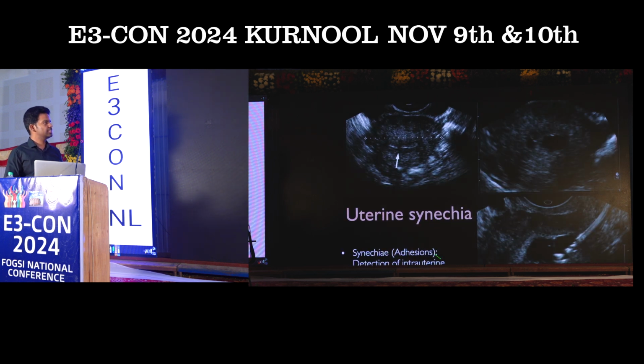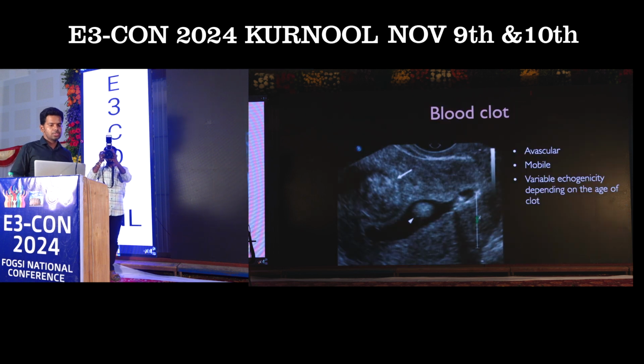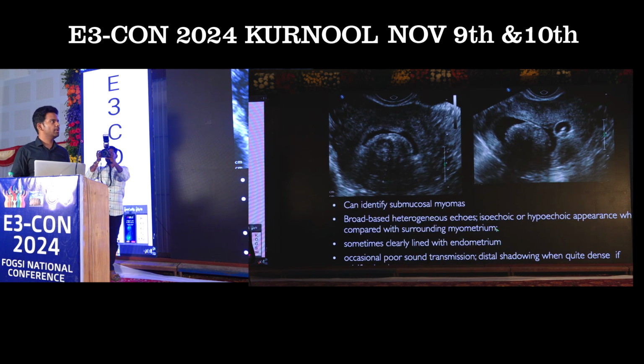And sonohysterogram has a major role where we can see adhesions in Asherman syndrome, where we can see clearly the adhesive band. This is a routine TVS finding. However, if we instill saline into the endometrial cavity, we can see the bands clearly.